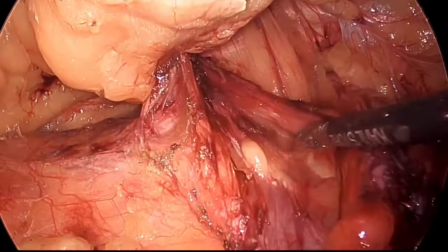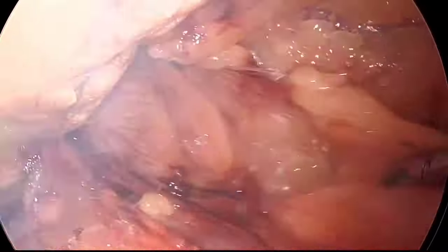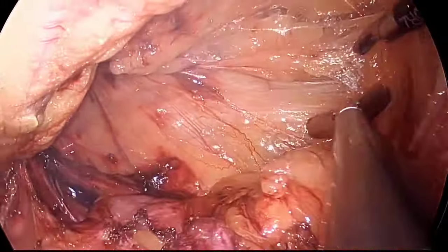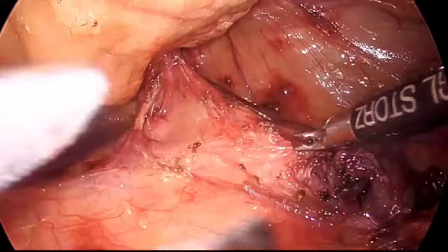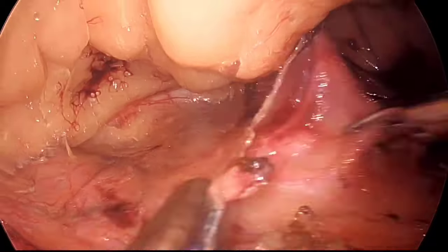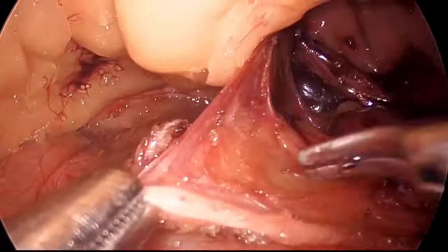Because of the previous surgeries, open inguinal hernioplasty twice in the groin, followed by open mesh explantation, the anatomy will be a little bit distorted. Along with the large defect in the indirect inguinal hernia area, there is also pulling of the gonadal vessels and the vas deferens towards the defect.